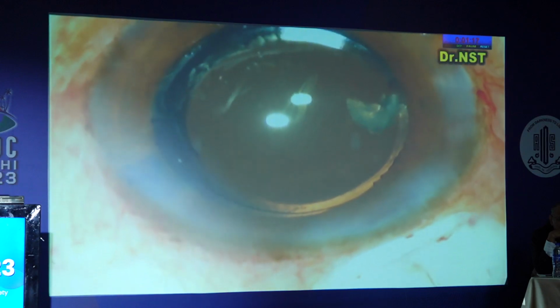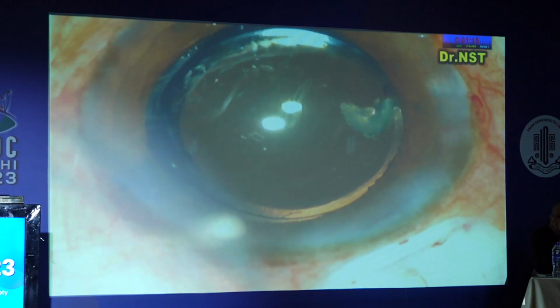And this is what I always try to tell during my surgical training program. People are coming for training even after 5 years, 10 years. I just salute them. But then I teach something different. You should feel the surgery. When I saw that this case was hypotony, these events will happen till the last moment. Because in hypotony, pieces can go in the angle and anywhere. And when you start the finishing step, especially with a fast cutting machine, some small piece like this will go. So happenings in phacosurgery is such a topic that can happen.